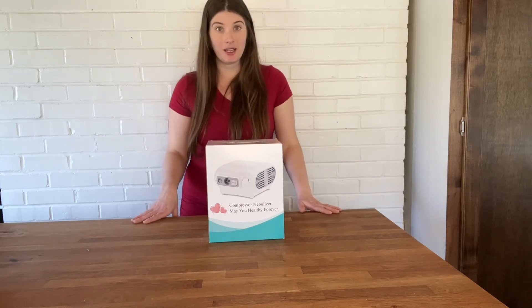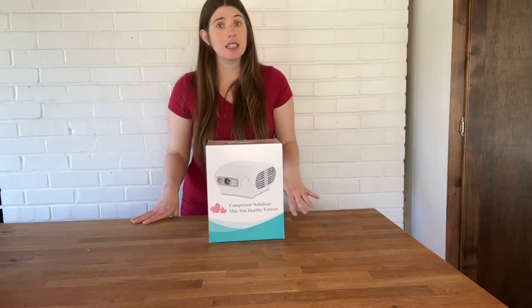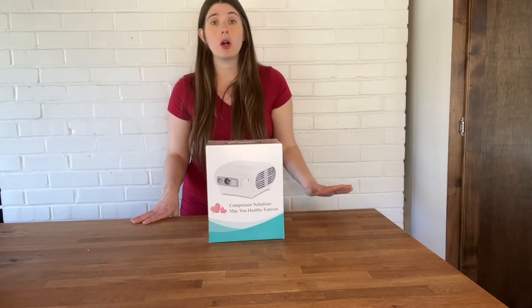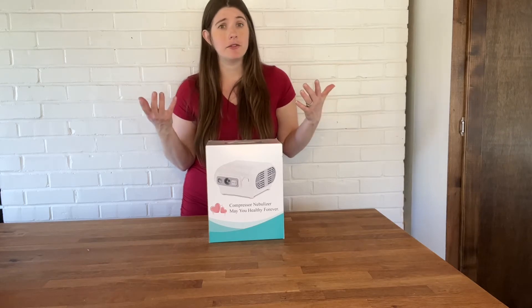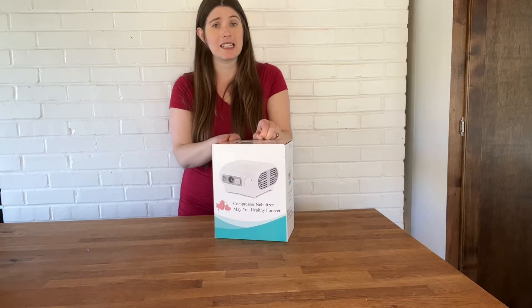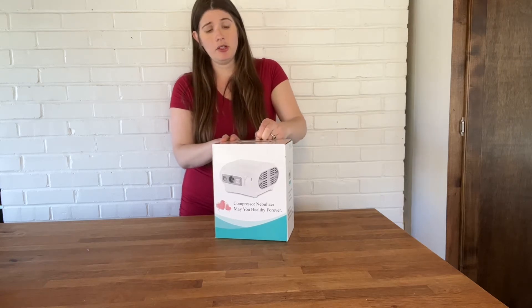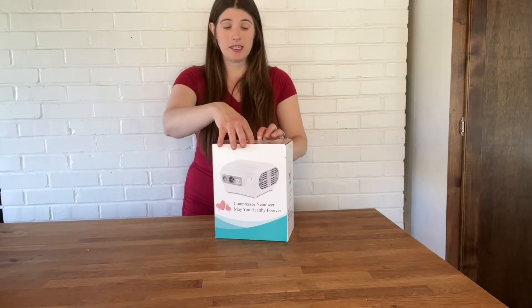Hey there, I want to show you this amazing nebulizer I just got. This is so awesome because it is easy to clean, it's affordable, the atomization can be from 0.5 to 5, and it can be used for adults and kids. I'm going to show you what's inside the box and how to use it today.